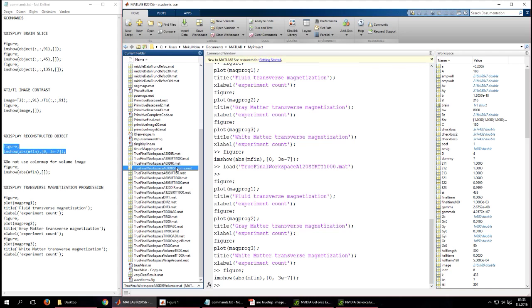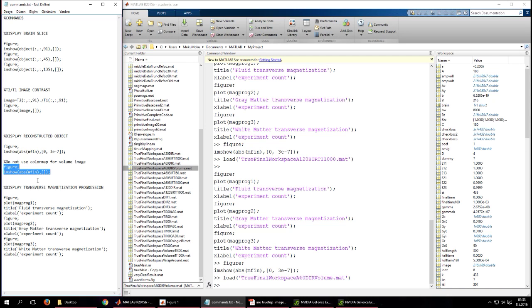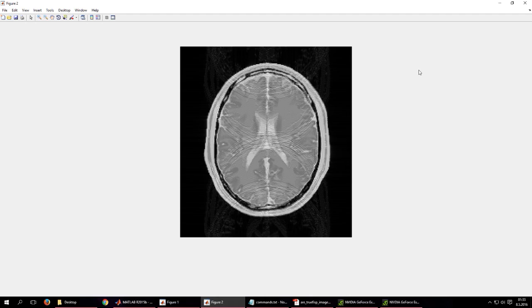I will not display this image with the color map I used for previous results because it has much higher intensity. And in the image we see that aliasing occurred in y direction because of contribution of other planes, but their contribution is weak, so the ghosts will not ruin the image too much. And we see that the boundaries between tissues are somewhat smoothed.